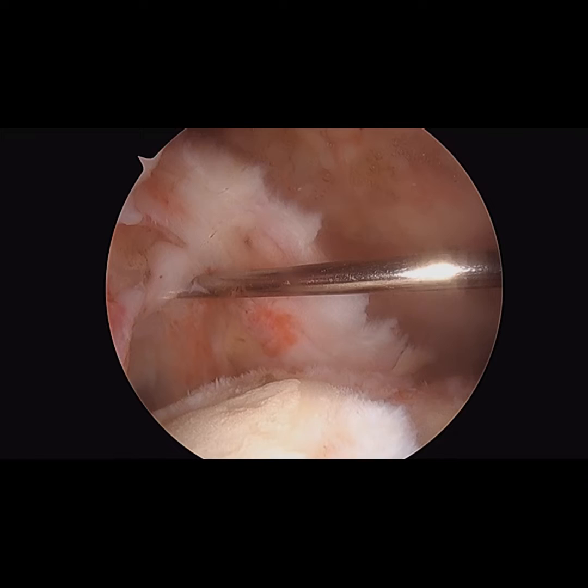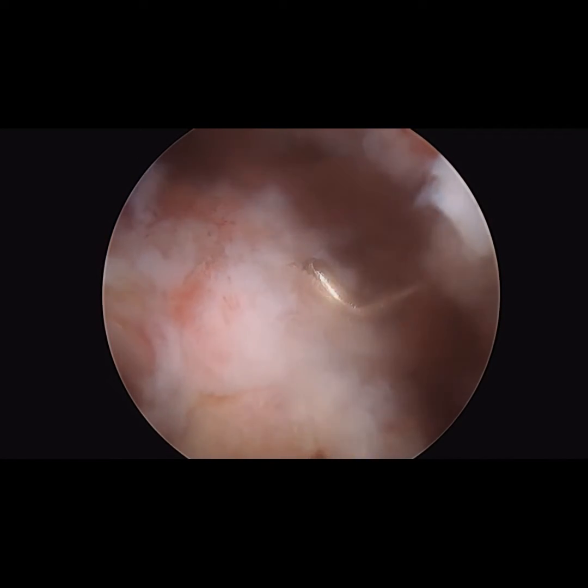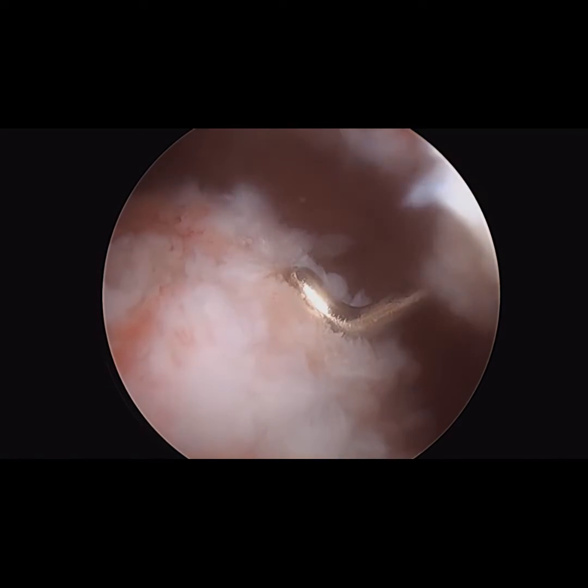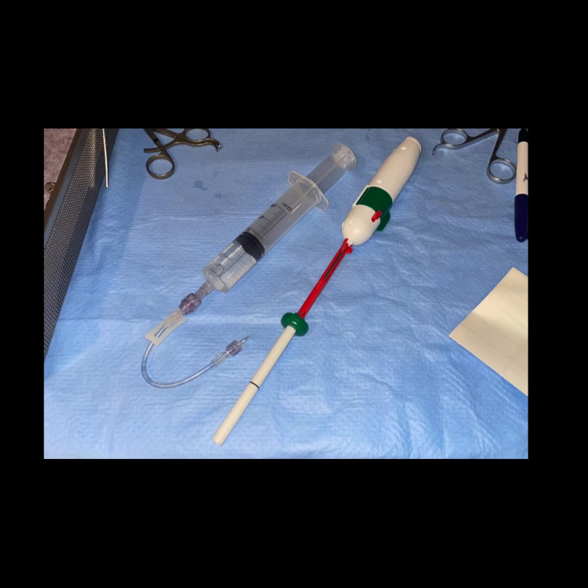Measurements are then taken with a probe from the glenoid, and then a second measurement is taken from the lateral aspect of the tuberosity. Based on these measurements, I then selected a medium-sized balloon.